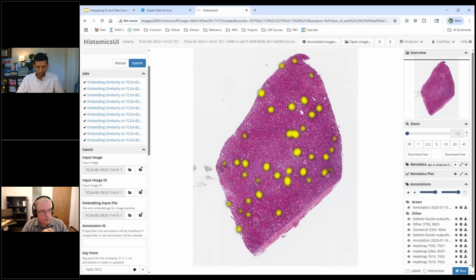We have some tools that do that in the radiology space. We are not fully there, we need more work on that, but that is just work. There's nothing challenging, no technical barriers other than time and funding. It's not an insoluble problem. It is just a matter of dealing with these different formats, because for annotations I've got points and polygons and heat maps and grid data types and XML markup and all sorts of other things you could add in, and you have to be able to say what is the way to correspond all of those together.